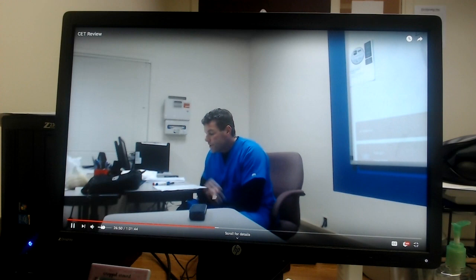54. Technicians assisting with an exercise stress test for an adult patient who goes into cardiac arrest. Which of the following actions should the technician take first? Stop the test, right? How long is a typical PR interval? D. 0.12 to 0.20 seconds. How many boxes? 3 to 5, right. Which of the following is the standard paper speed on an EKG?